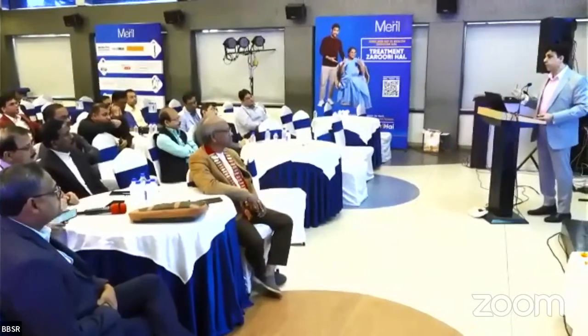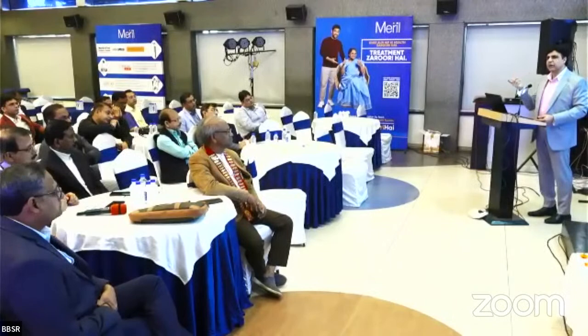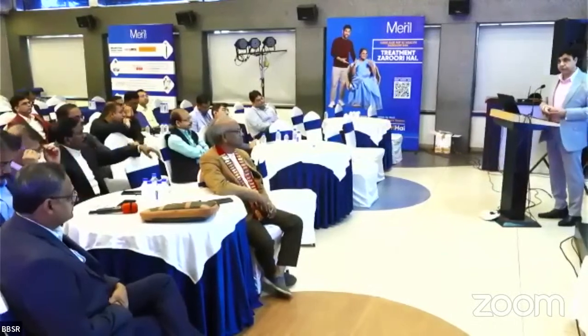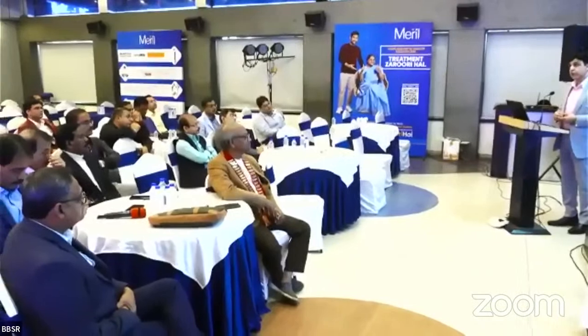So as long as you have a good accuracy of cuts, you have a good bone stock, now materials is not an issue. We use the same materials for the hip also. You require porous materials with a high coefficient of friction. The moment you have those, I think uncemented is not an issue. But the question is, does uncemented give you, like in a THR, an extended life portfolio?